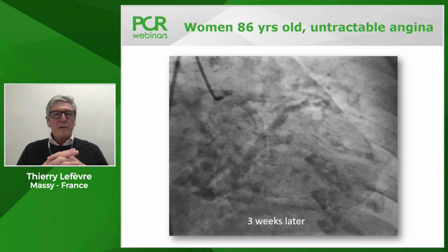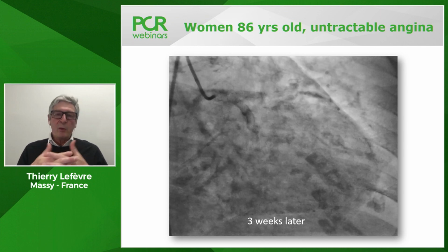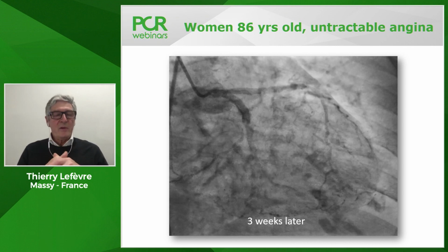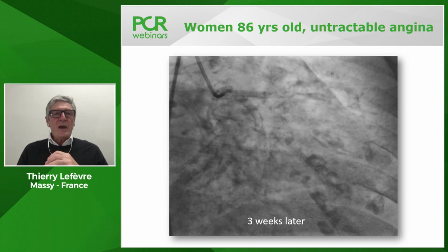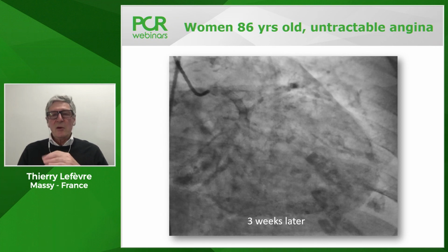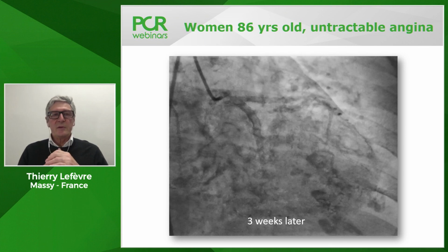If you are in the learning phase, of course, you should use it before and after, and before when it's not dangerous for the patient, but at least after. And if you have any doubt during the procedure, if something is going wrong, you should also use intracoronary imaging. I think it's very, very important.